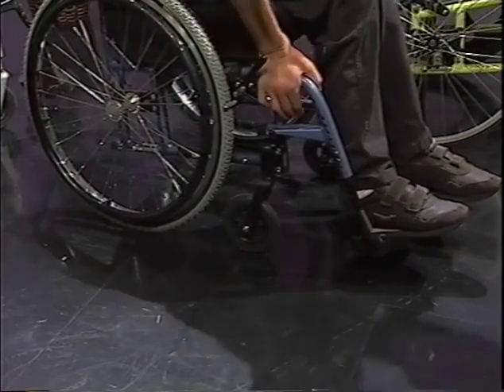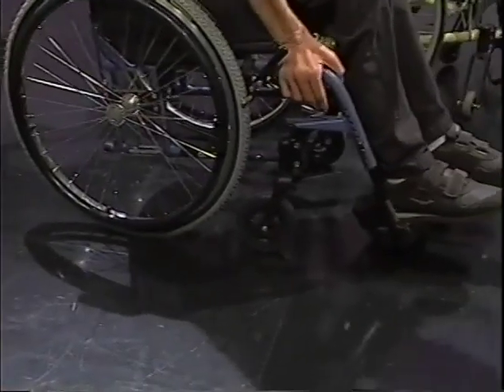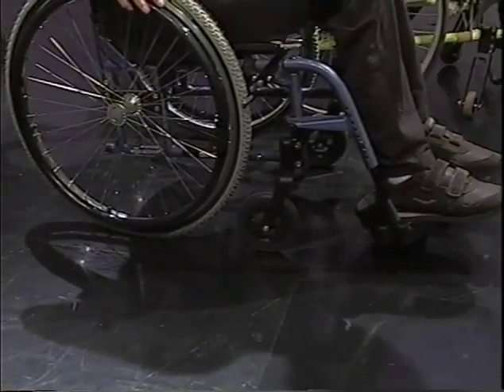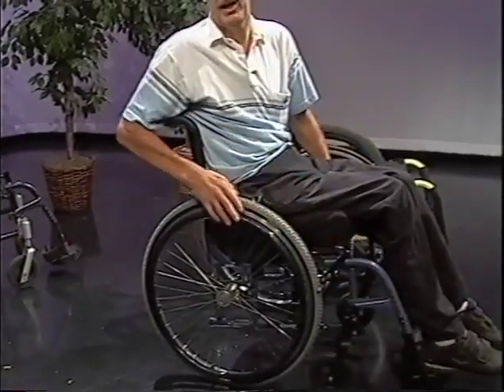But the problem with this chair is anytime you put weight on it, the whole chair wants to stand up on its nose. And if you're transferring and you're putting weight on a chair, the back wheels are all that holds you stationary in place because they're the only things that lock. So every time you transfer, your weight comes off the back end and the chair stands on its nose. That's a horrible thing to have when you're rolling along on rough terrain like the grass. Just playing bocce the other day, this chair almost dumped me out 2 times on a flat bocce grass court.